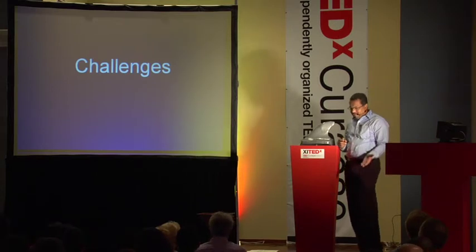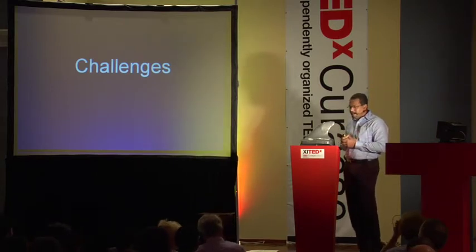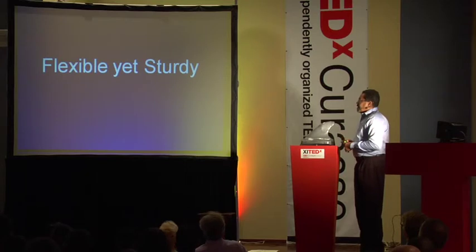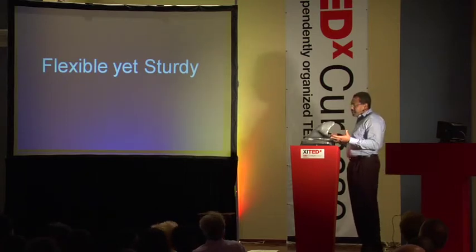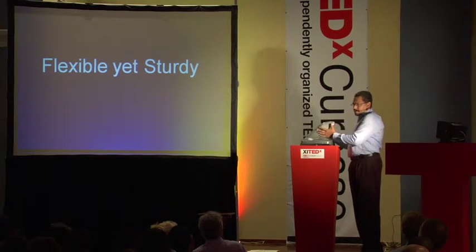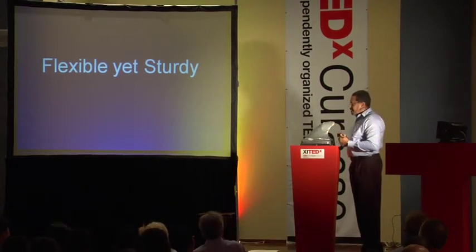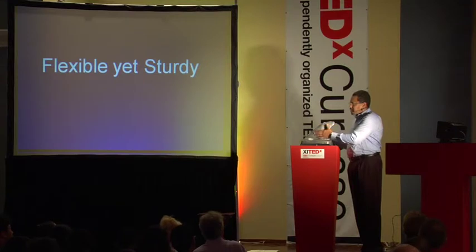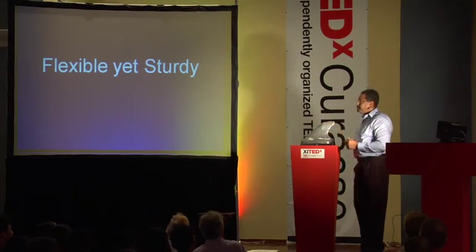So what were we facing when we want to do something like this for a dolphin? Well, that's what I discovered. It had to be sturdy on one hand to support the two sides of the wound. It had to be sturdy because the normal fin also is sturdy in the front and very flexible to the back.